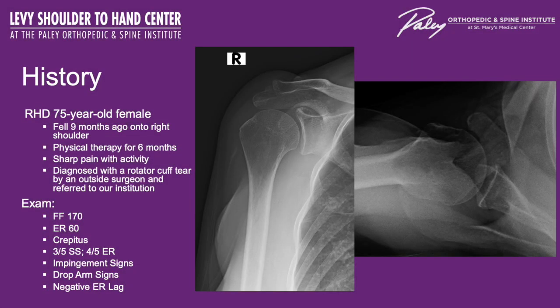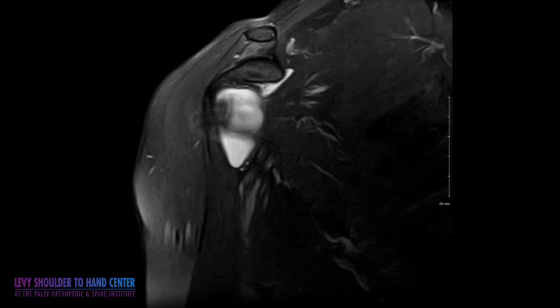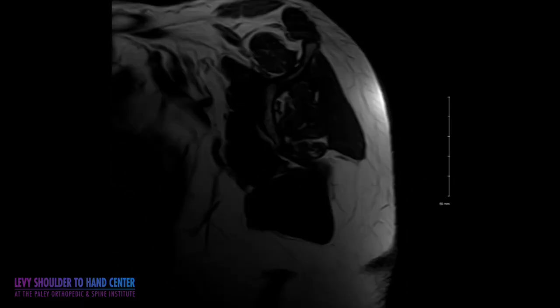This is the history of a 75-year-old right-hand dominant female who fell 9 months ago, creating a traumatic tear of her rotator cuff. She failed therapy for 6 months, had pain, good motion, but weakness to rotator cuff, supraspinatus, and external rotation strength without an external rotation lag sign. This MRI demonstrates a full-thickness retracted rotator cuff tear to the mid-portion of the humeral head with biceps tenosynovitis. There are no arthritic changes, and there is no atrophy of the rotator cuff musculature.